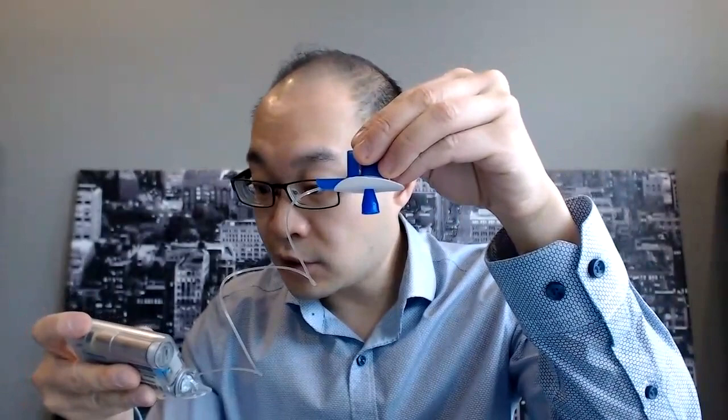Okay? So before I connect this onto myself, there's actually a bunch of air in the tubing here, which I don't want in my subcutaneous tissue. As you can see on the instructions, it says to fill the tube, which I'm going to do now. And if you look closely, you should be able to see some drops. There you go. I don't know if you can see it with the video, but a bunch of drops just fell down. And connect to the body after fill, yes.